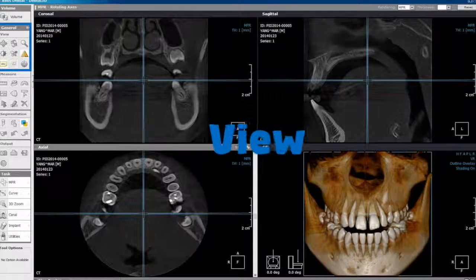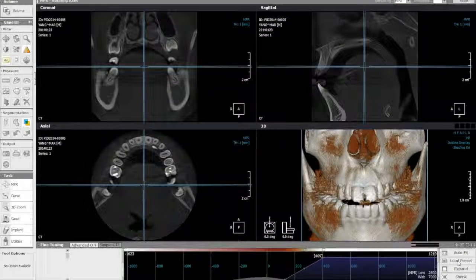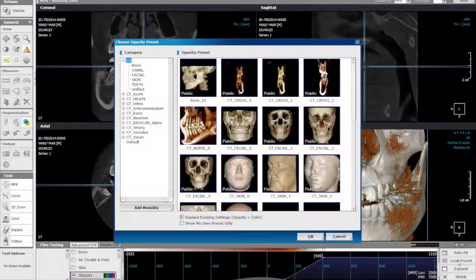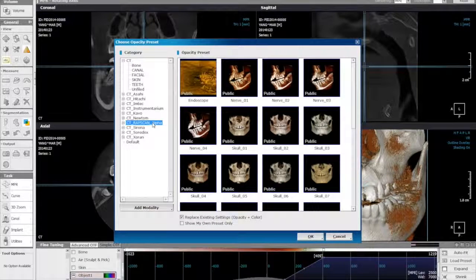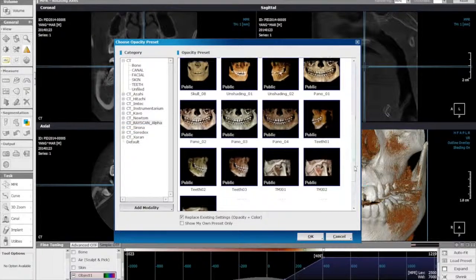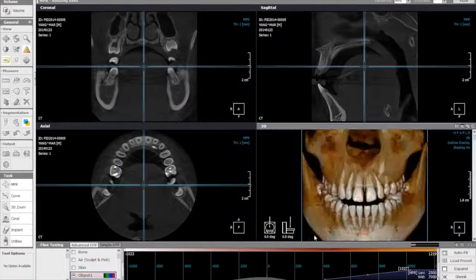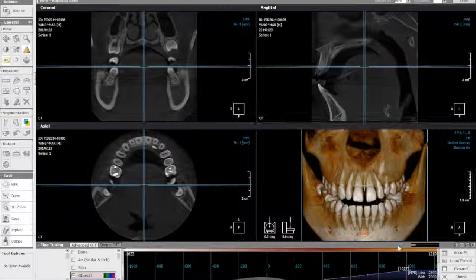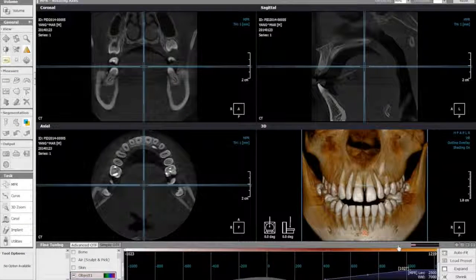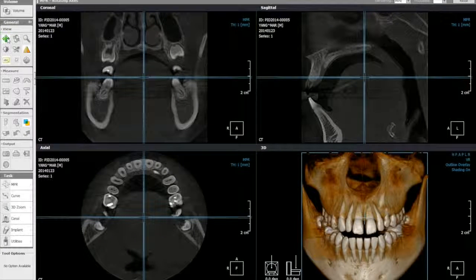Utilizing tools in view windows. You have a series of tools on the left side, as well as fine tuning options at the bottom. Simply click the bottom bar and select load preset. Find RayScan and choose the preset for your clinical purposes. The MPR views are often the more important ones where you can actually see the image. The first section is the basic view manipulation tool.